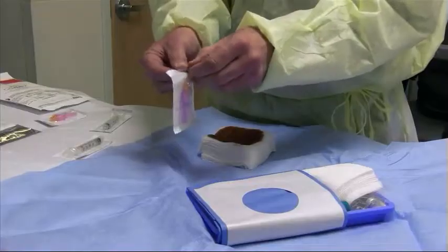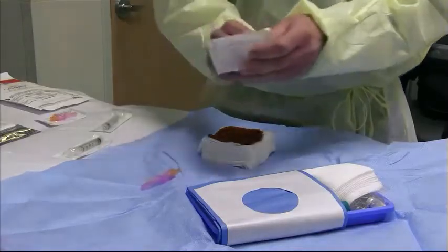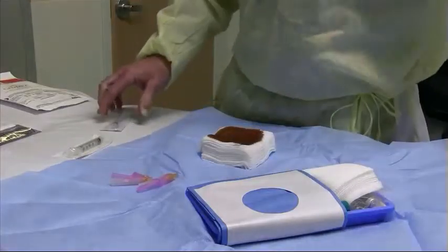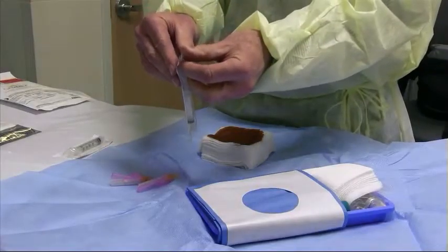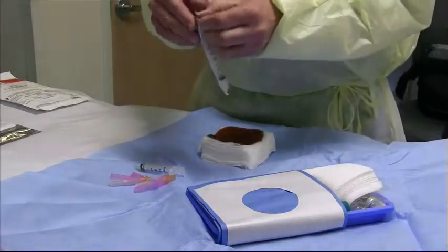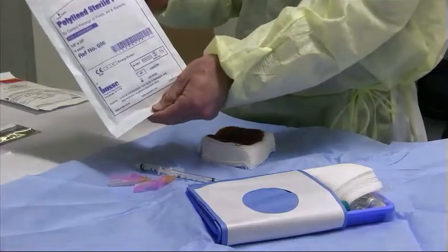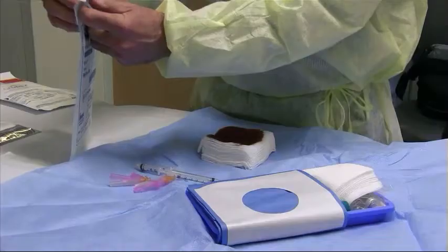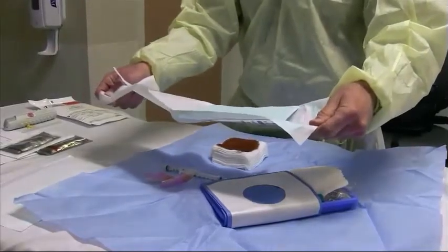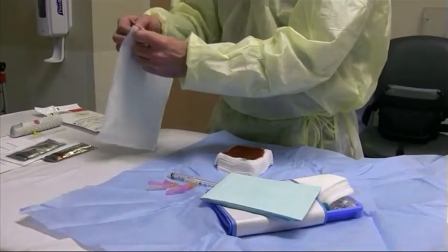Other things we will need specifically for a fine needle aspiration of the thyroid are 25 gauge needles. These come pre-packaged with a butterfly opening on one end — you carefully pull open and let it drop onto the tray. We usually use multiples of these, three or four, placed on the tray. We will also use 3cc syringes, opened in a similar fashion, letting them fall onto the tray. Also necessary are sterile drapes, which come pre-packaged with a butterfly opening — carefully drop onto the tray. We generally use two of these to drape the patient.